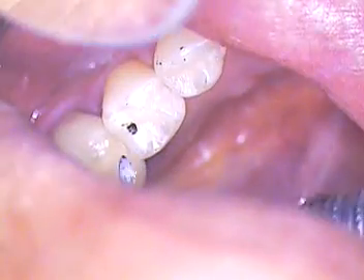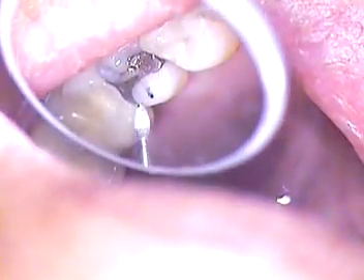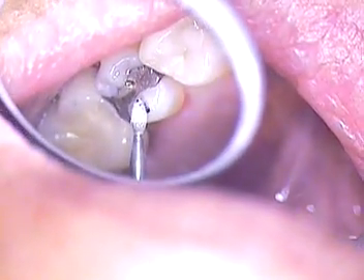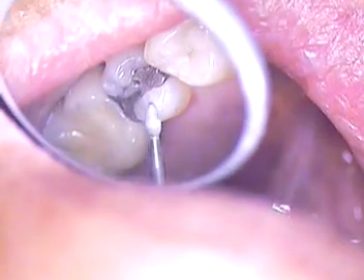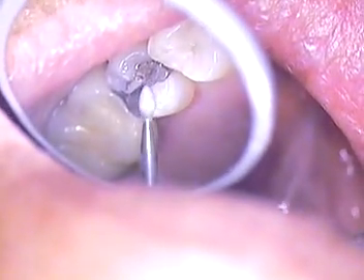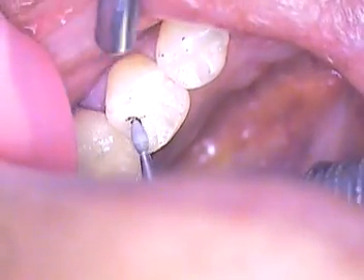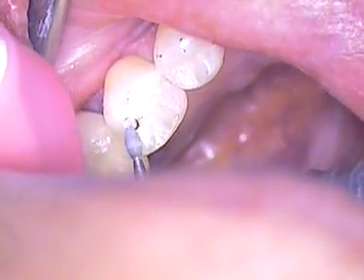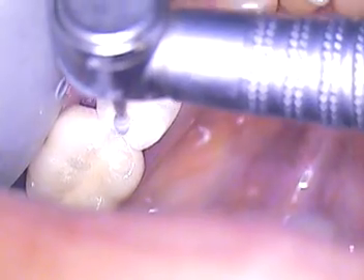What happened was the old filling wore down and made a real saucer-cup kind of relationship. So I'm going to do just a little bit of dusting right here, a tiny bit. That's all I need to do. Now we'll work the rest of it right down in here. After we adjust her bite, we'll polish again, and that's it from this end.